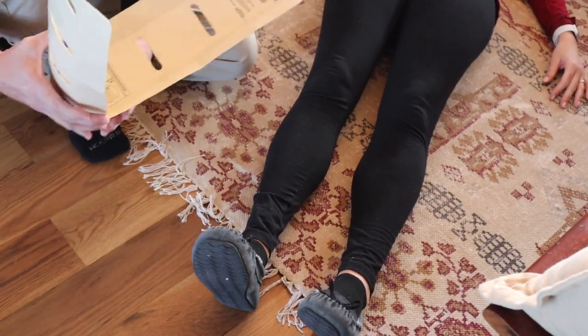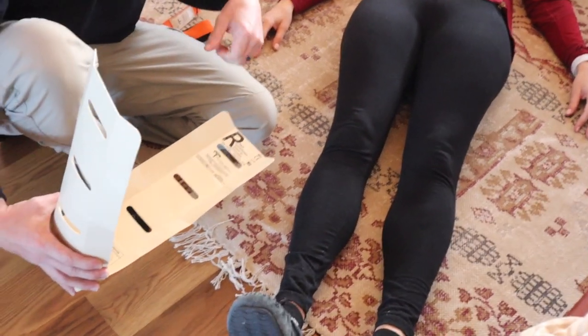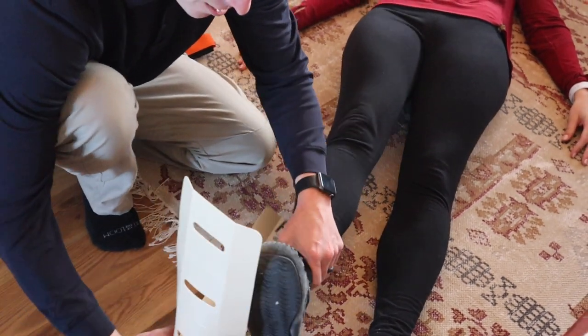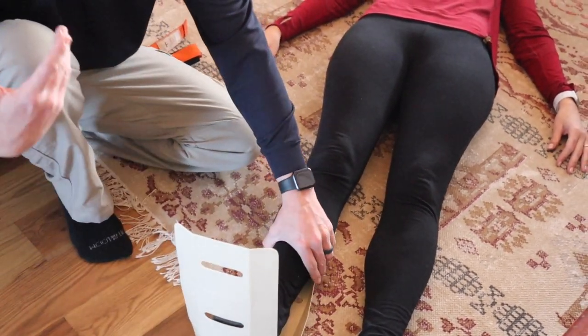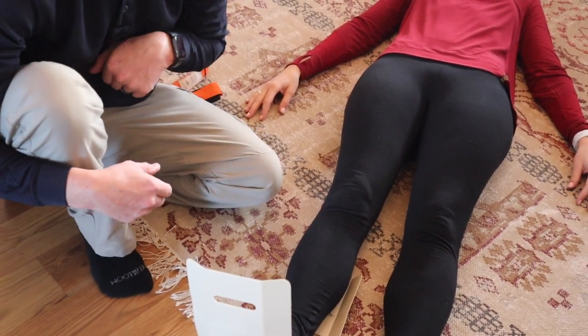Now that we have it at a 90-degree angle already, we can secure the ankle — she fell in the living room. You could use some padding here, like a t-shirt or towel where needed, then wrap and secure it. Check pulse, motor, and sensory again.